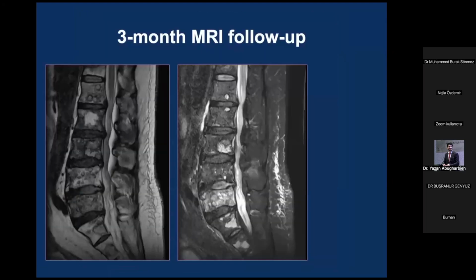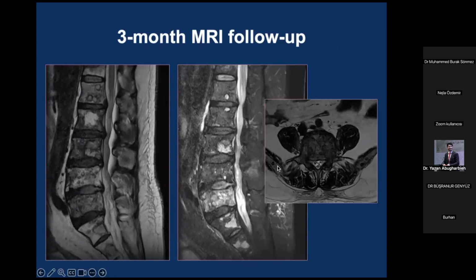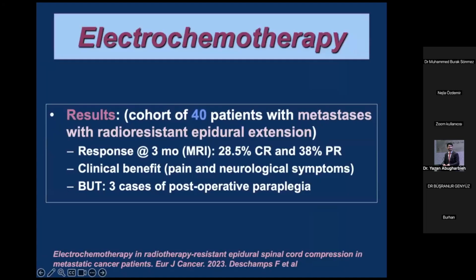And here you have the 3-month MRI follow-up. You see a complete disappearance of the epidural component that was present before the procedure, a complete disappearance of this epidural extension.